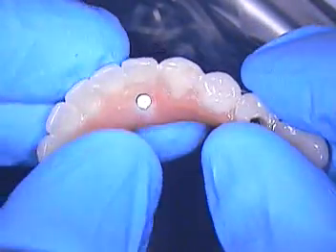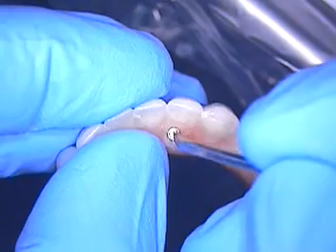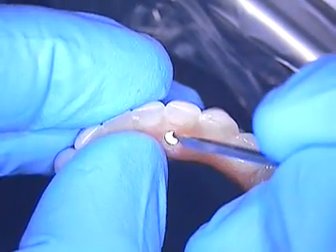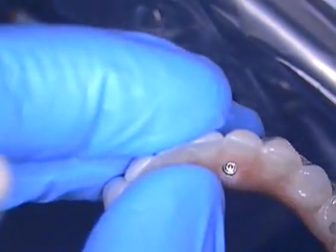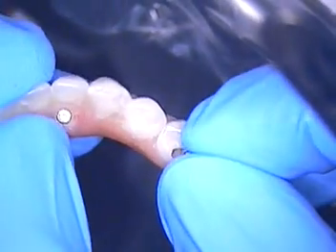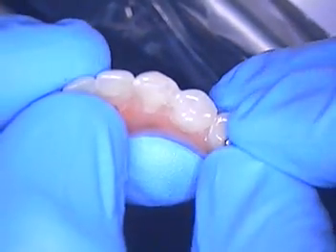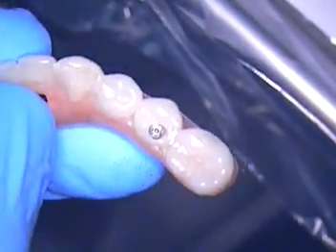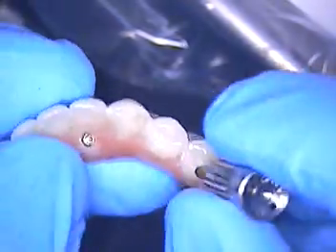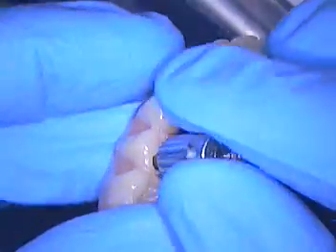And it's always good to check the path of insertion too. Like, see this dropped in, but boy, it was a little tight going in there. So you gotta make sure that the access hole doesn't have acrylic that inhibits the path, because some of these screws are a little angled. The screw access holes are slightly angled. Alright, just verify that goes in. That one does. This one, and as well as this one.